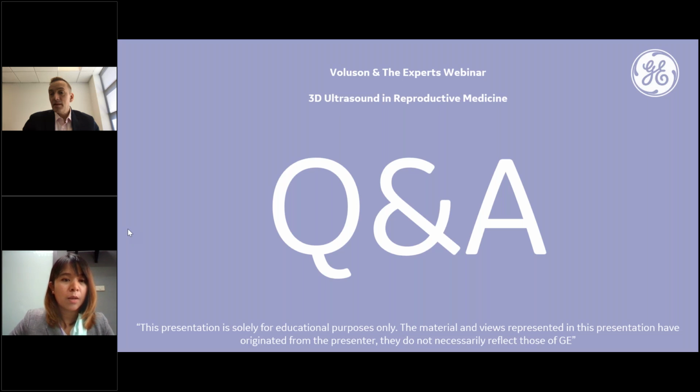Okay, thank you. Move to the next question from our participant. Do you use ultrasound to assess endometrial receptivity? If so, how do you use it?